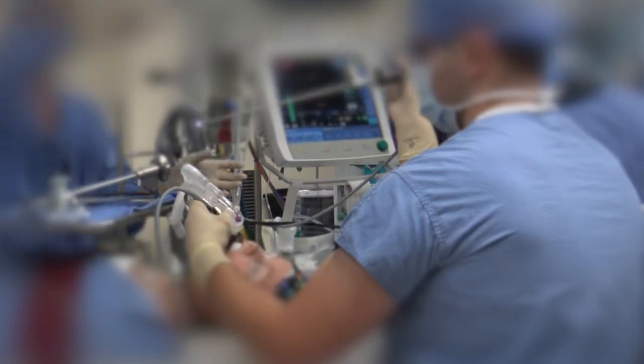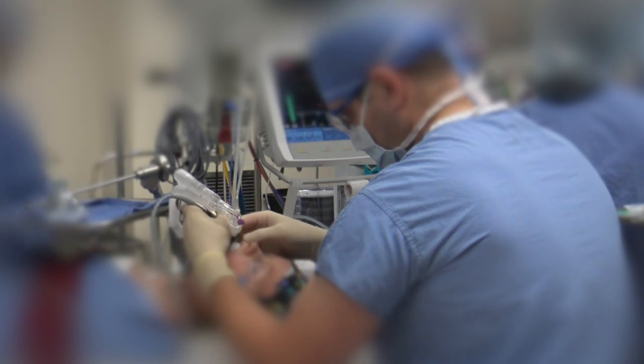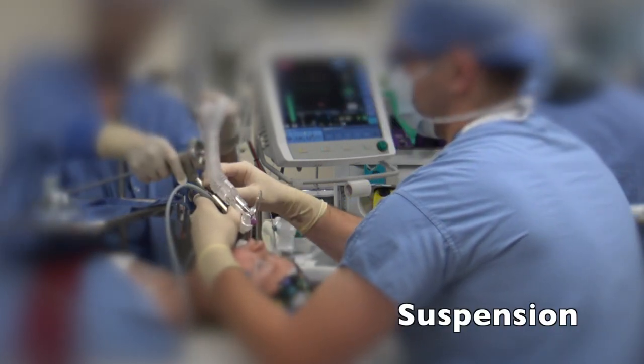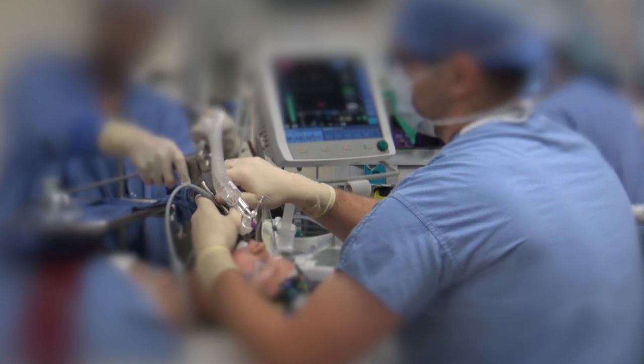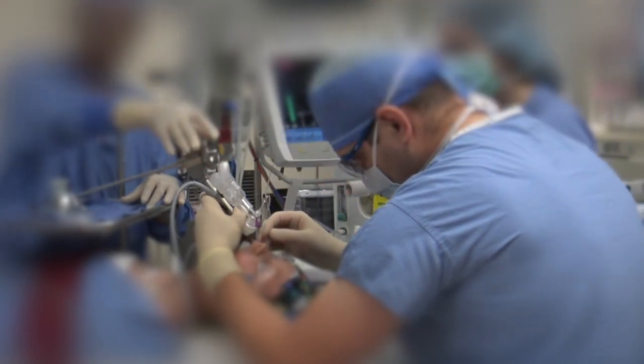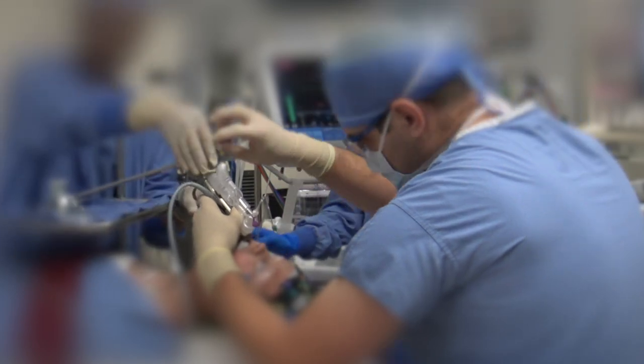We then would generally suspend the laryngoscope with a chest support. This can either be set on the patient's chest if it is an older patient or, typically as seen here, with use of a Mayo stand.